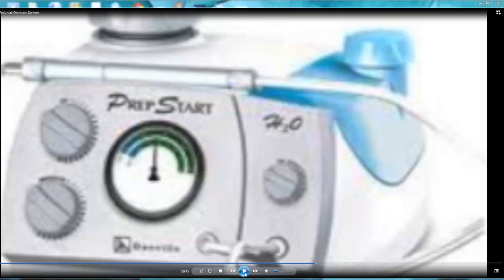I've been using 27 micron aluminum particles and 40 psi pressure, so I can reduce any irregularities on the tooth structure, any debris from the tooth structure. So my impression or my scan will be nice and clean.